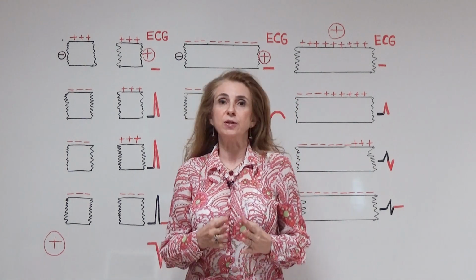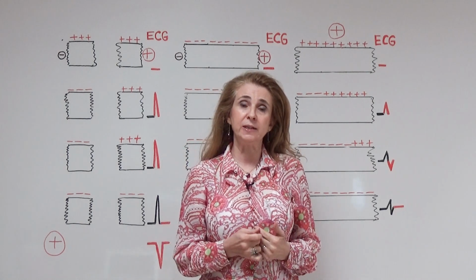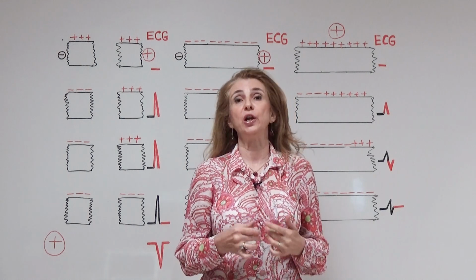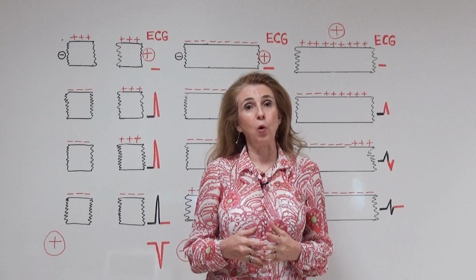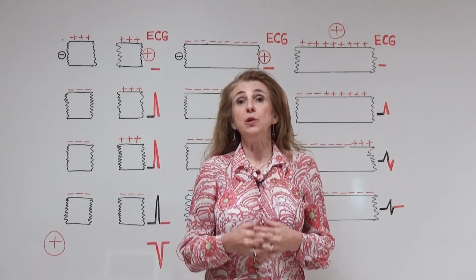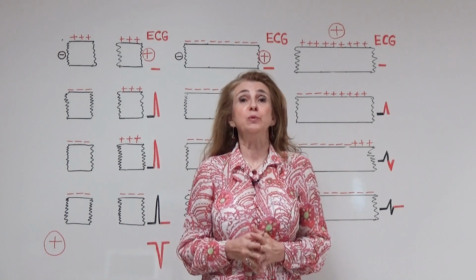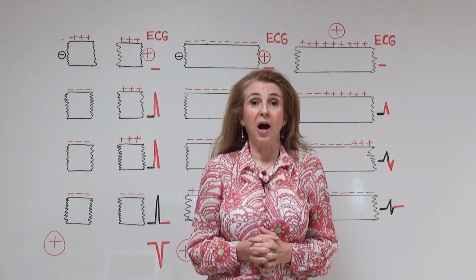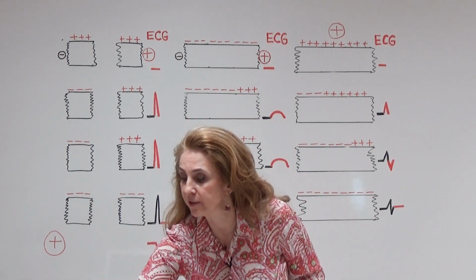Electrocardiography is an extracellular recording. In case of extracellular recordings, the charges on the outer surface of the cells are important. So electrocardiography records the dipoles or the bioelectrical potential differences between the outer sides of two different groups of cells, muscle cells, in our heart. So let us have a look at these two different groups of cells.